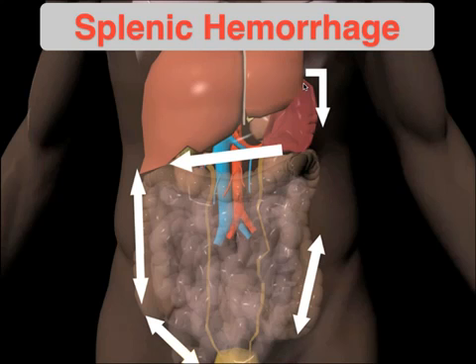So even if you forget most of this other discussion on anatomic considerations, just remember to look in the subphrenic space, and to also remember that Morison's pouch is a key area for fluid localization, whether it's coming from the spleen, the liver, or even a pelvic source. So you can see here, once the subphrenic space fills, fluid is going to go across the lesser sac over to Morison's pouch and down into the pelvis.